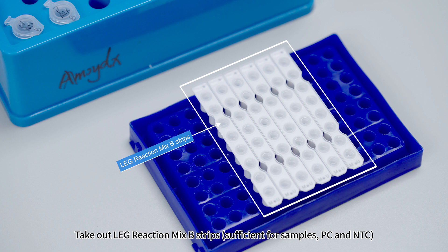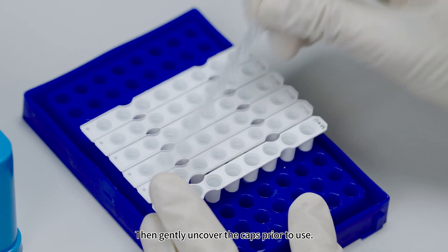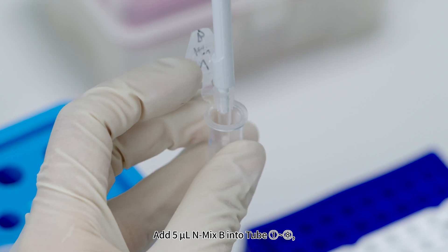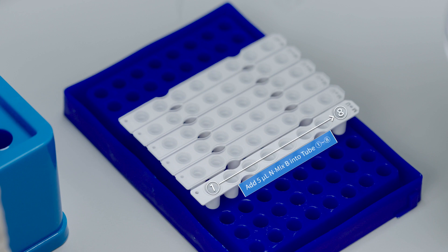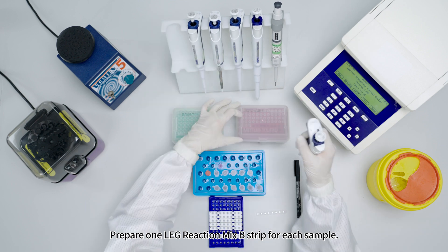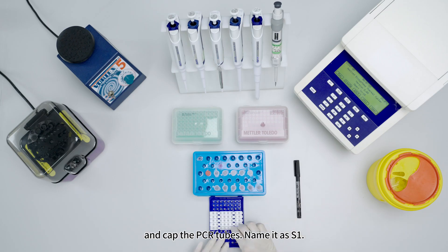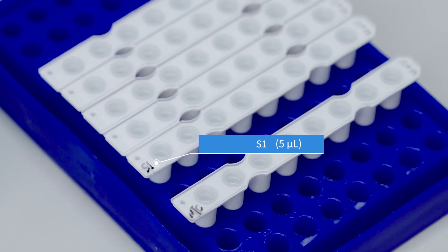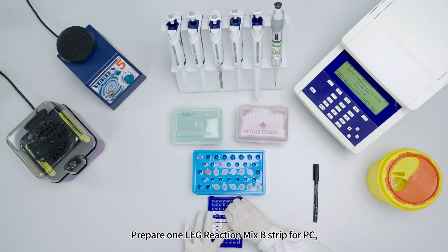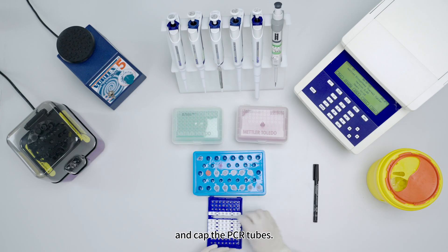Take out LEG Reaction Mix B strips sufficient for samples, PC, and NTC; centrifuge and gently uncover the caps. For NTC, add 5 microliters N-Mix B into tubes 1 to 8 and cap. For each sample strip, add 5 microliters of the corresponding sample mix into tubes 1 to 8 and cap; name as S1 and repeat for remaining samples. For the PC strip, add 5 microliters P-Mix B into tubes 1 to 8 and cap.